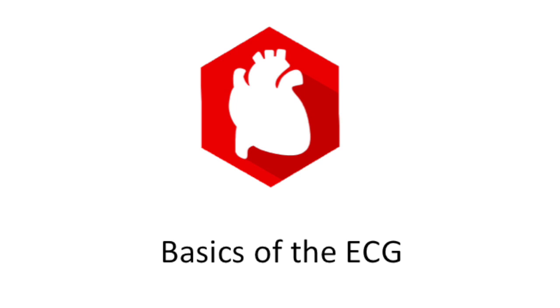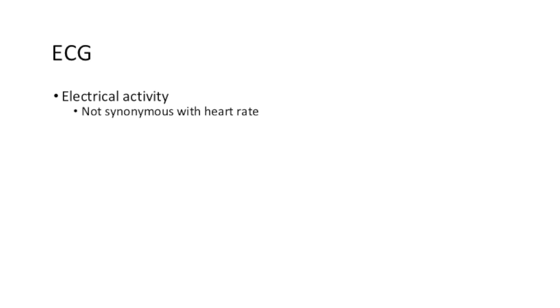As such, there's so much variation. Normal people, the so-called normal ECG can vary remarkably because there's just so many different variations, and the heart by itself is such a complicated organ, and when you go down to molecular detail and talk about electrophysiology of the heart, it becomes even more intricate. Just before I start, I'll quickly mention that an ECG only records electrical activity, it does not record the actual mechanical action of the heart.